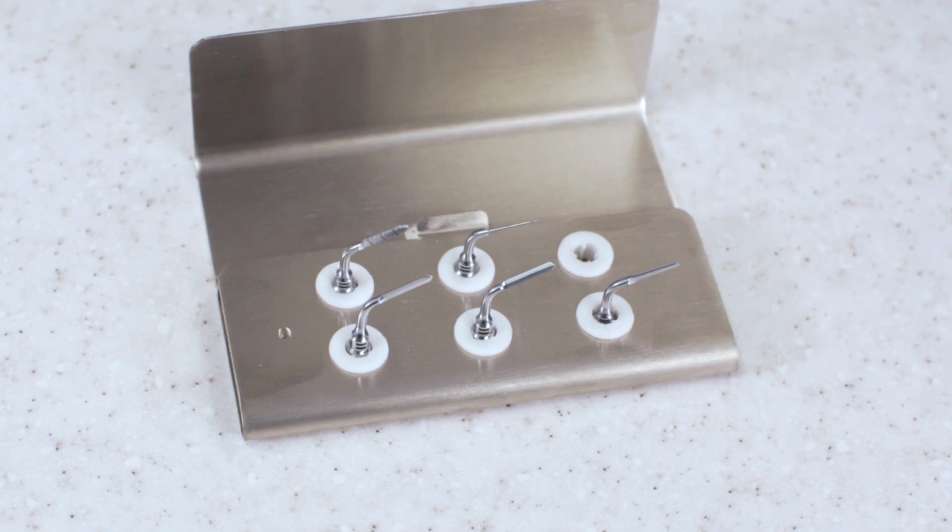These kind of act as a luxator, and the tips are put in the periodontal ligament space. The tip must be placed parallel to the root, and it's important to not try to lever with these, but to just go straight down in the periodontal ligament space and try to separate the root from the bone. So you want to separate the PDL space. It cuts away bone and helps safely surgically extract impacted or tough teeth.